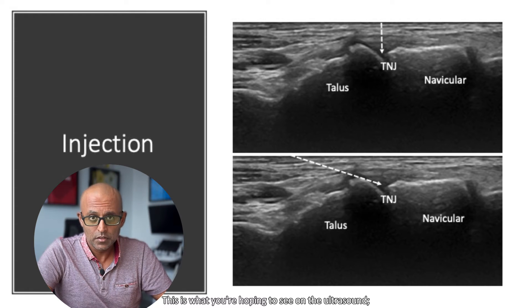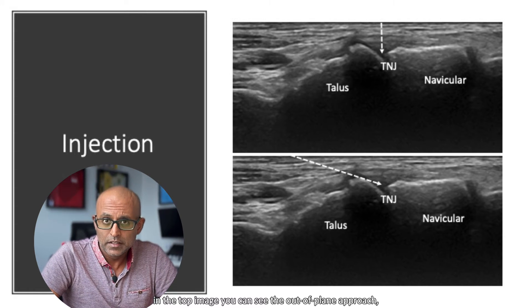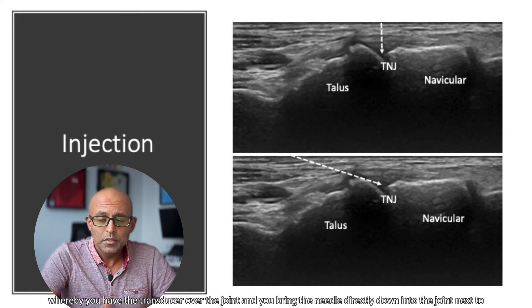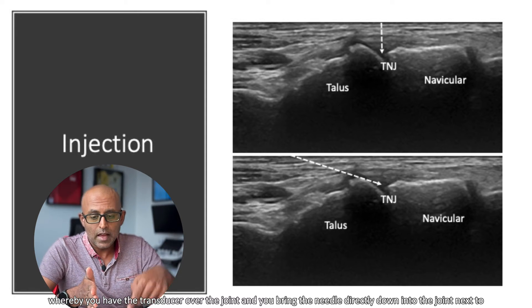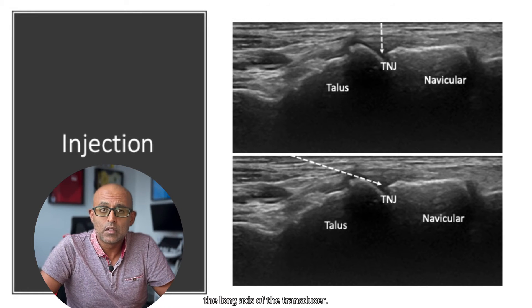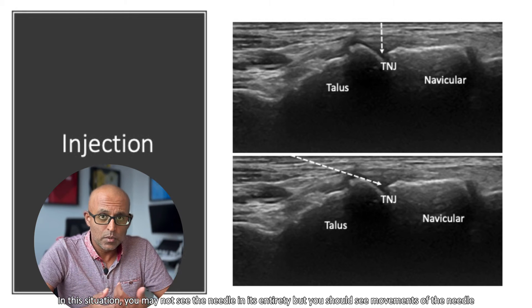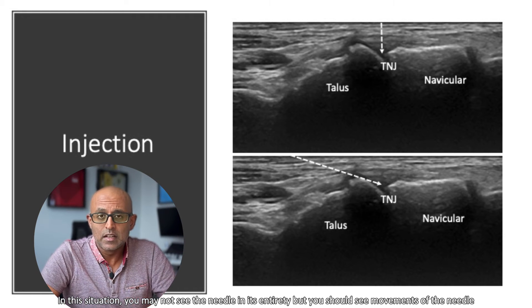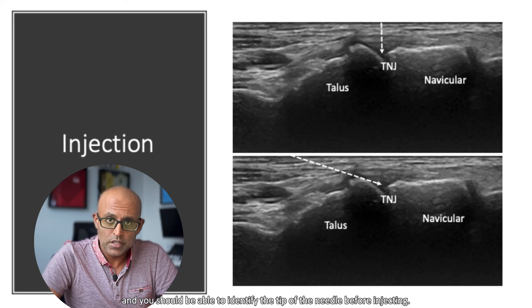This is what you're hoping to see on the ultrasound. In the top image, you can see the out-of-plane approach, whereby you have the transducer over the joint and bring the needle directly down into the joint next to the long axis of the transducer. In this situation, you may not see the needle in its entirety, but you should see movement of the needle and be able to identify the tip before injecting.